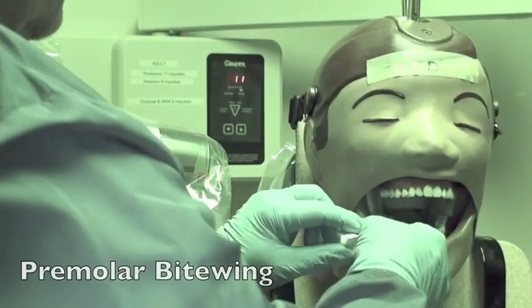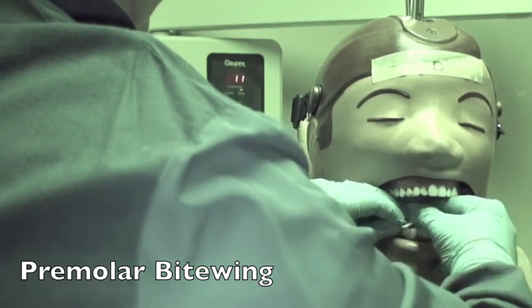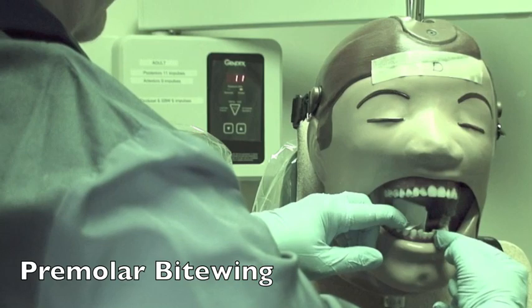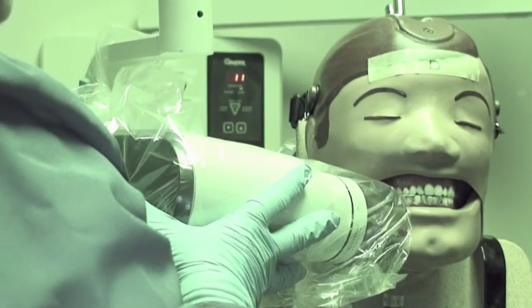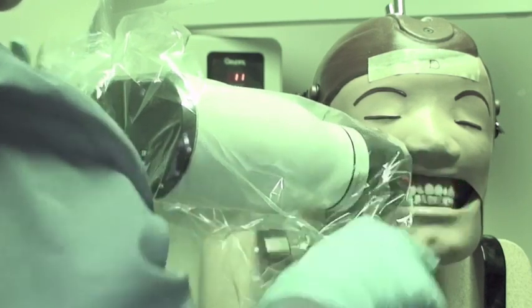For the premolar view, in order to get the distal of the canines on most patients, you can get that view by going across the arch to the opposite lateral canine. Have them close. Then aim again with positive 10 angulation, between the first and second premolar. Then check the occlusal plane.